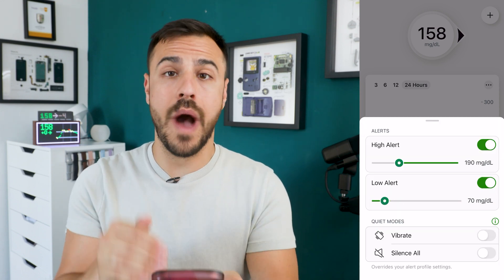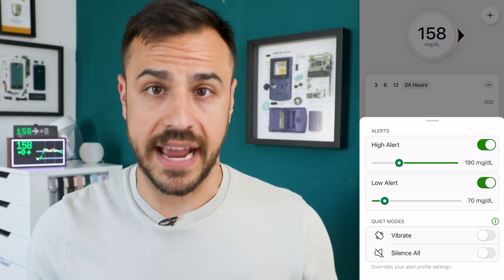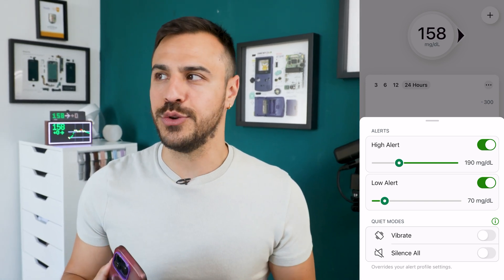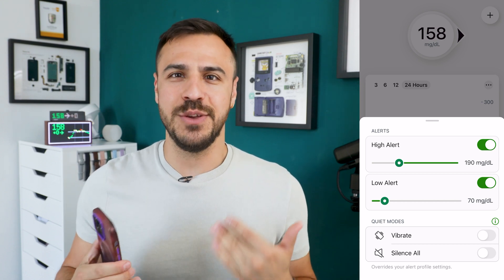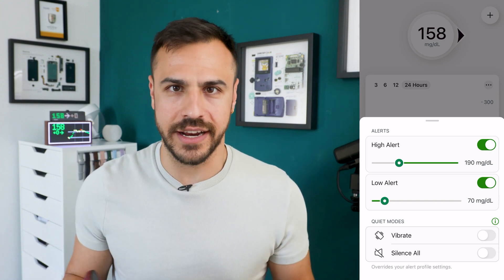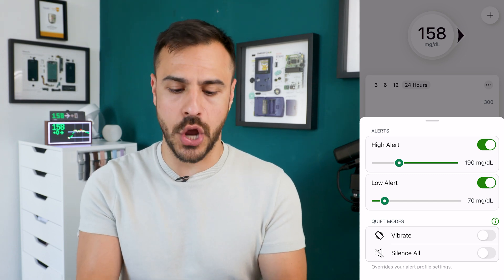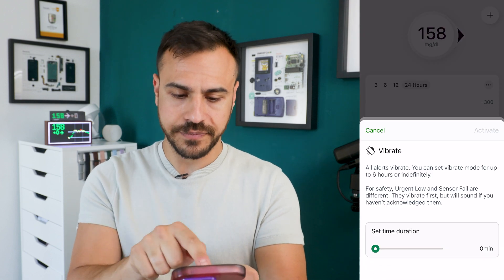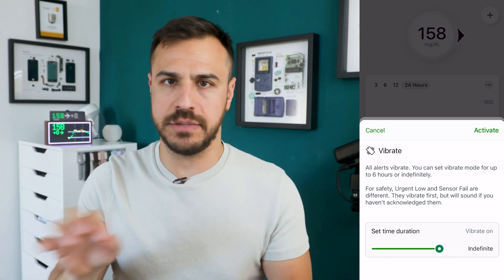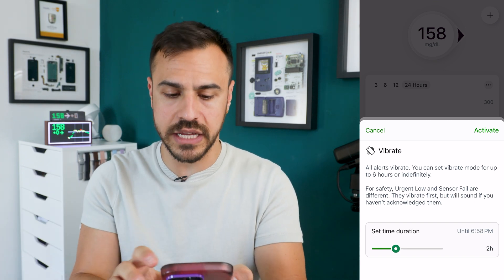Quiet modes are one of my favorite things with Dexcom G7. They've given me so much more comfort going into Broadway shows or movies, because you always have that anxiety of, am I going to get an alert in the middle of a show? So first you've got vibrate — when I toggle that on, up to six hours or indefinitely, all alerts will vibrate. I typically put this at two or two and a half hours, depending on how long the show is.